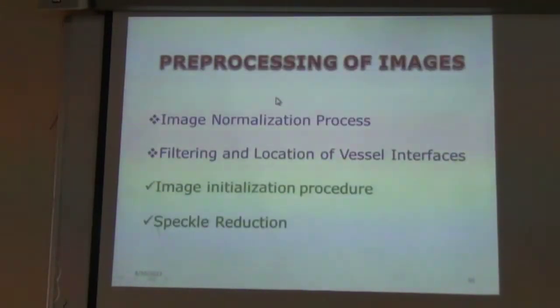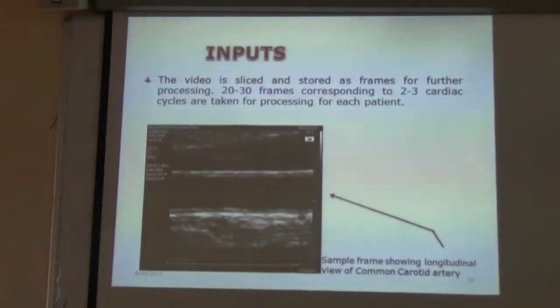Previous. Stop. See here. That 3x3 filtering has been started from this extreme end up to this. And in what way the vertical pixel values start from this lower lumen to one maxima, the adventitia, up to this profile value of that intensity. Clear? So that filtering has been done for each and every pixel from this band up to this band. Then only can you average it and locate where the wanted portion actually is.